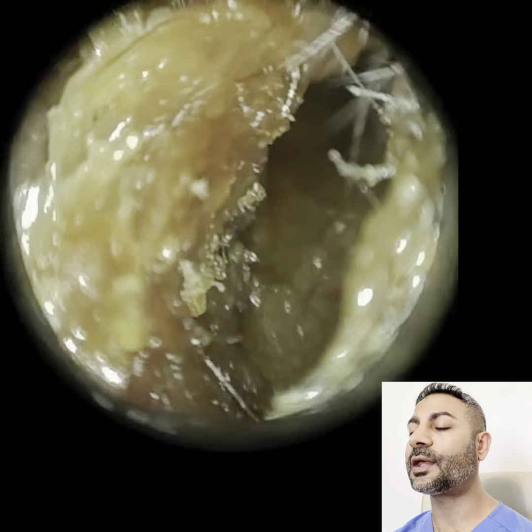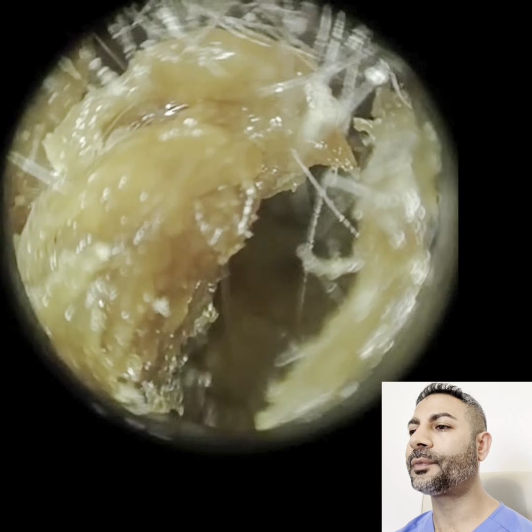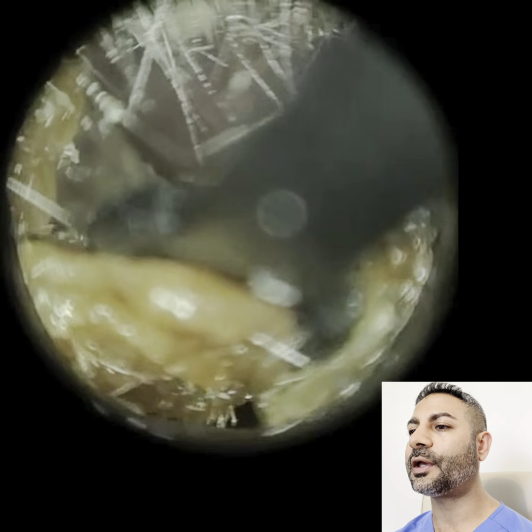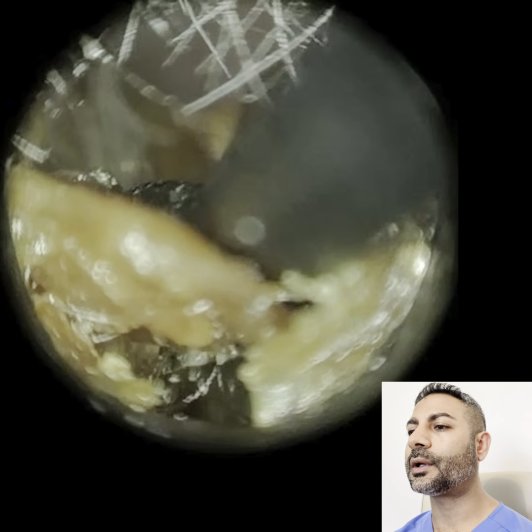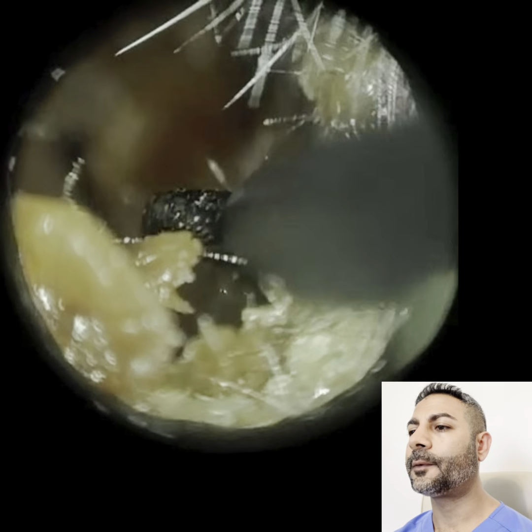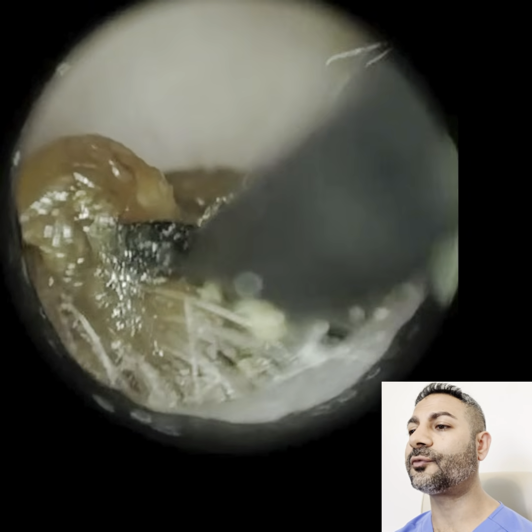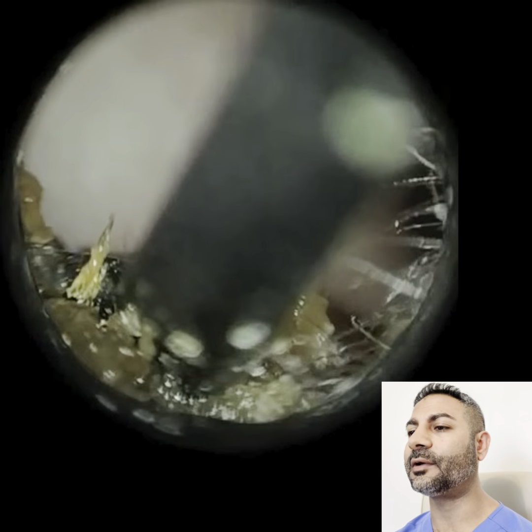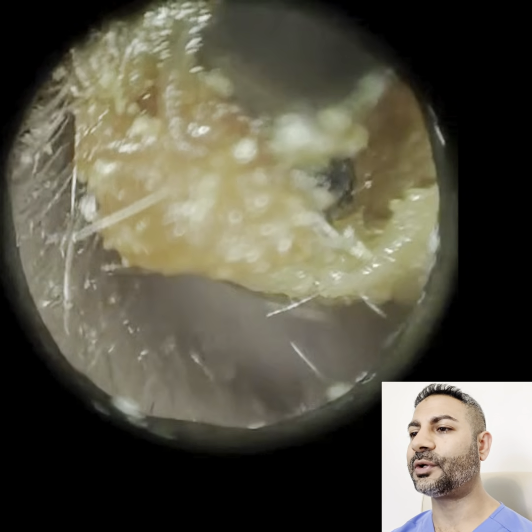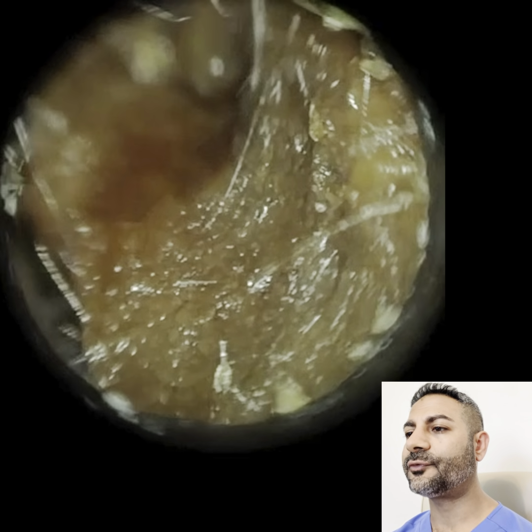There's a bit of dead skin as well. I'm going to use the ear hook again in a moment. There's one piece that was quite firm, but I'm just going to remove this section here. I think we use the curette again, just getting over and beyond. And I'm just going to slowly glide this forward. Now, if this wax was any softer, it would smear against the floor of the ear canal. There was a bit of smearing here, but it was dense enough to kind of coagulate. So as I was bringing it away, it wasn't staining the canal. It kind of came out in one piece.